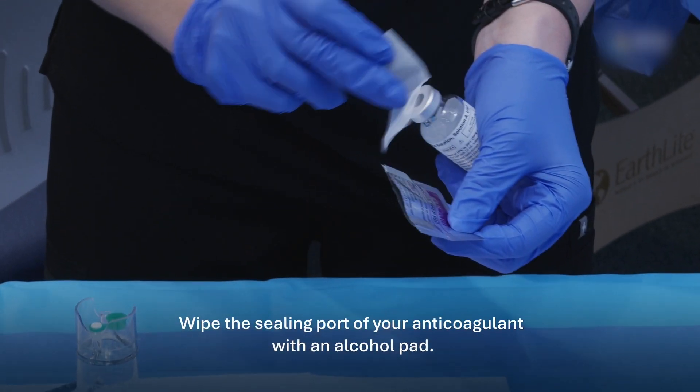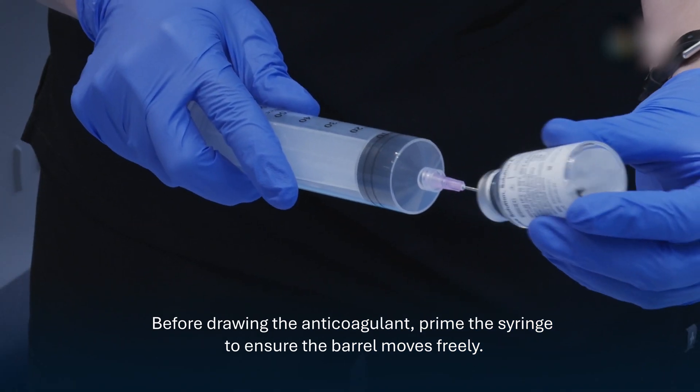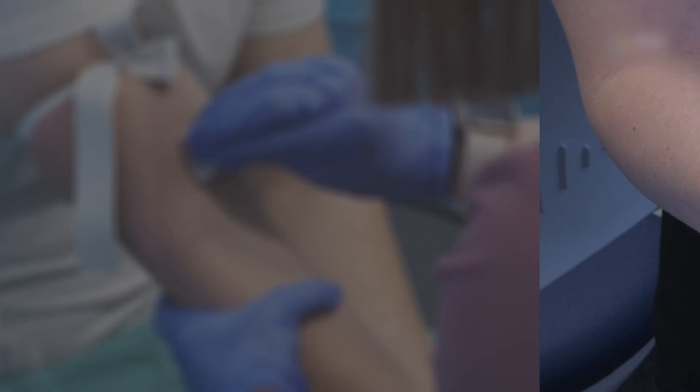Wipe the sealing port of your anticoagulant with an alcohol pad. Before drawing the anticoagulant, prime the syringe to ensure the barrel moves freely, then draw six milliliters of anticoagulant into the 60 milliliter syringe.